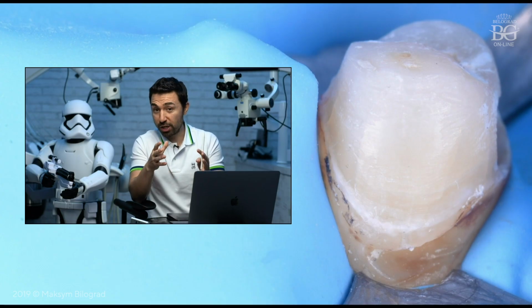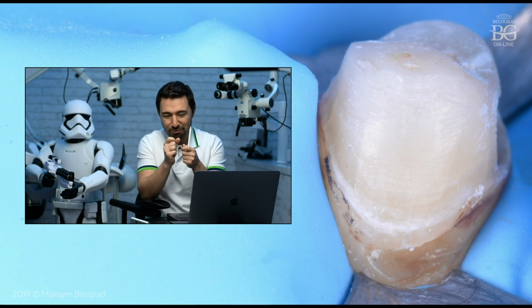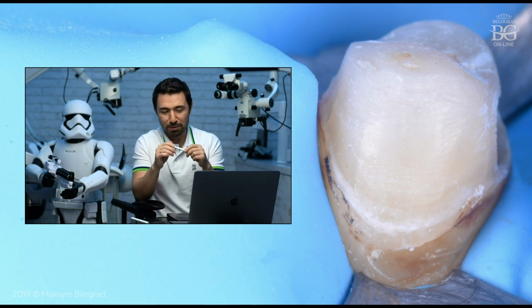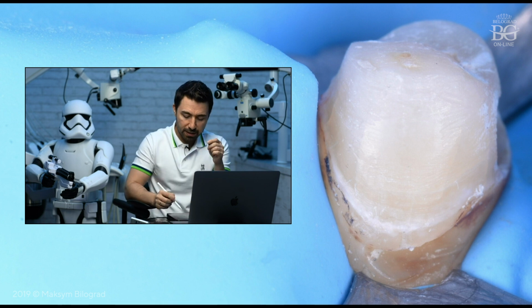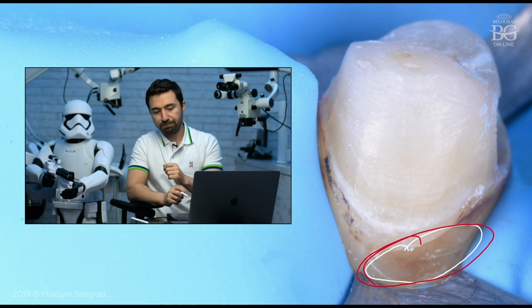The first case is when I removed a hammered metal bridge, which is old, very old-fashioned dentistry in Ukraine and post-Soviet countries, by the way. Very thin metal crowns that nobody uses nowadays except sometimes in the villages in post-Soviet countries. I removed the metal bridge, and I was super surprised that we had enamel all over this tooth. But the problem was that we also had this cervical caries defect here.